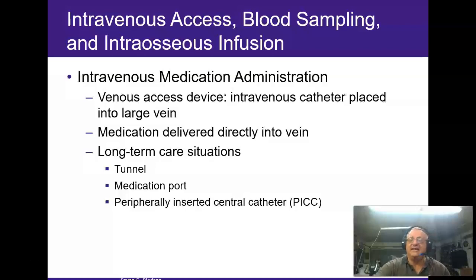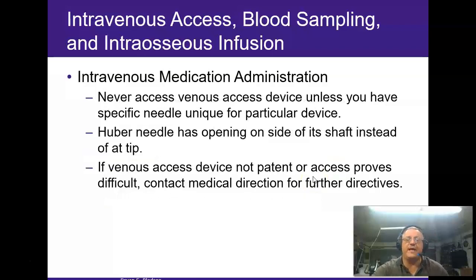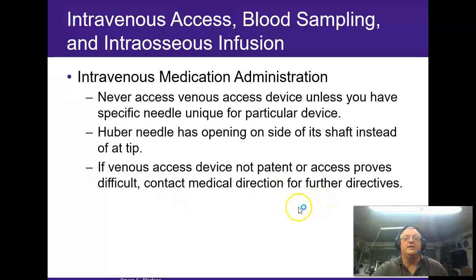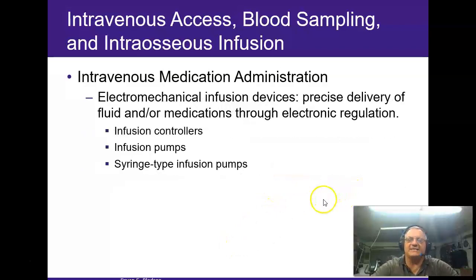So again, it's something that can be used. I think there's a lot of fear about it that there shouldn't be. But as a rule, gang, we usually don't use the PICC lines to administer things. We start our own IV. Usually the reason these people have an IV like that is because there's no access on them. By the way, these port devices use a Huber needle. It's kind of like a 90-degree needle, and I'm going to show you one of those in class and in the lab session. But we usually do not access those ports, especially if it's a subcutaneous port. We just don't do it, okay?